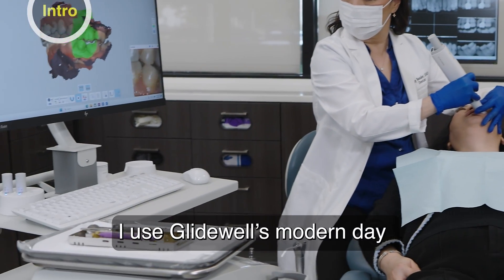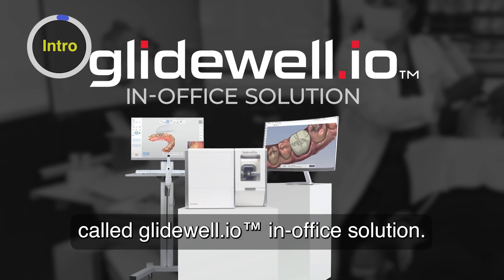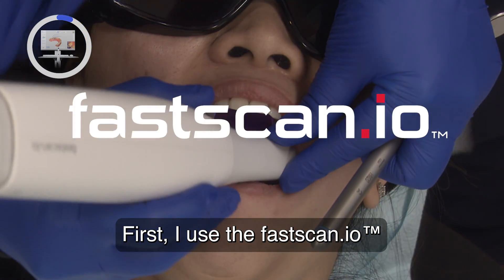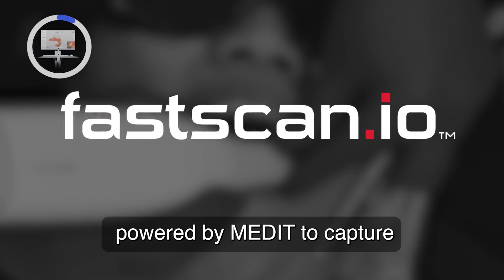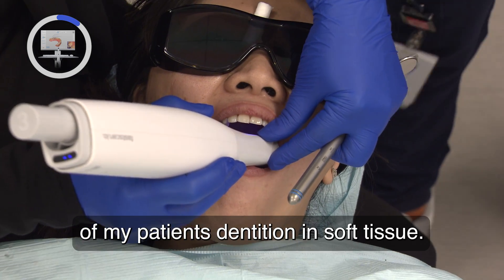I use Glidewell's modern-day CAD/CAM system called Glidewell I.O. in-office solution. First, I use the FastScan I.O. powered by Medit to capture an accurate digital impression of my patient's dentition and soft tissue.